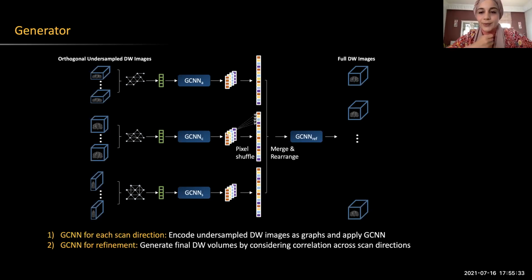Okay, cool. So basically, intensity images from the diffusion MRI. What is the value of each pixel in your image? It's an intensity block, right? It's a 3D block, right? It's like a cube. Actually, I can say it is more like a 4D block. A 4D block, yeah.